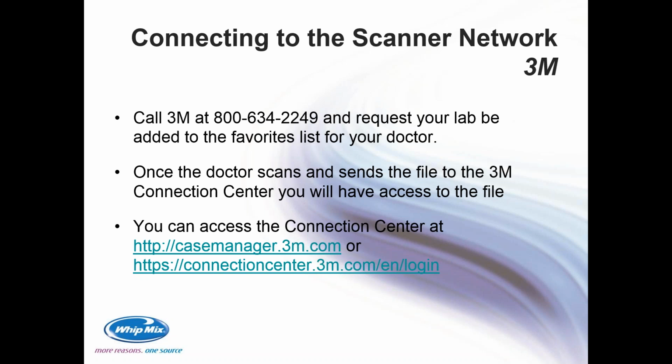And at that point in time, you would download it to the margin marking software to mark the margins, or to that third party, as we referred to before. Those first 30 cases have to go to a margin marking party. And then these files would be sent back to the Connection Center. So they get downloaded, they get the margins marked, they get sent back to the Connection Center, to where at that point in time they can be converted and then imported into, say, ThreeShape Dental System, ExoCAD, Dental Wings software for the digital design and product of restoration and orthodontic appliances.